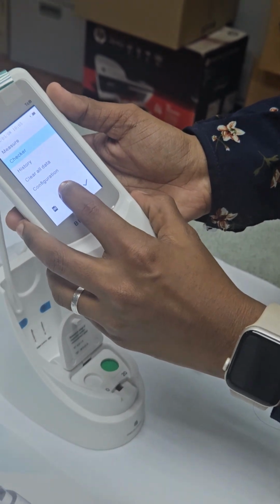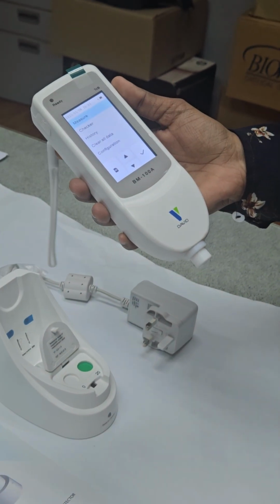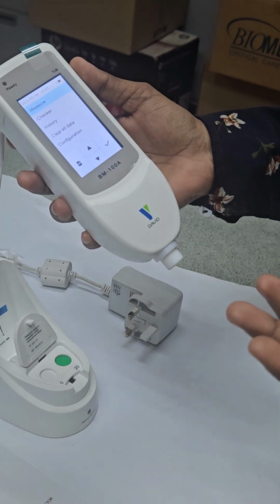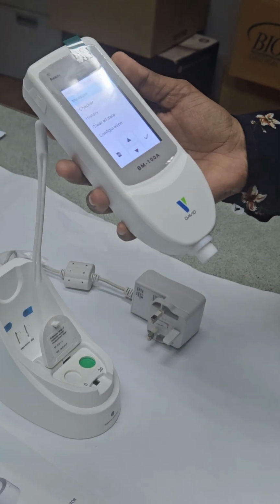Normally one day they do how many times? Only one time? If it's the first time for a new patient, they check if there's jaundice, then they will proceed to phototherapy. After phototherapy, after the treatment, only then will they check, or they will proceed to the blood pricking.